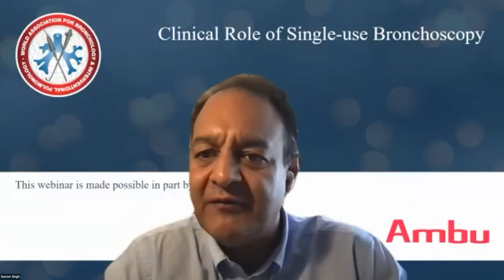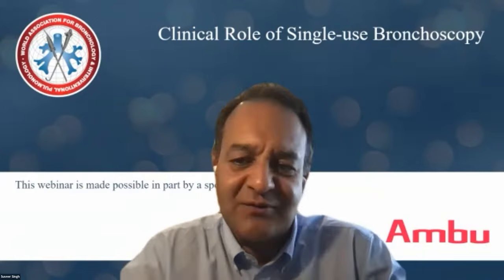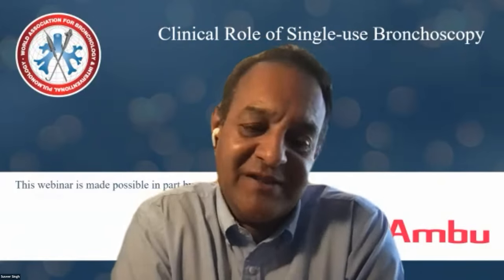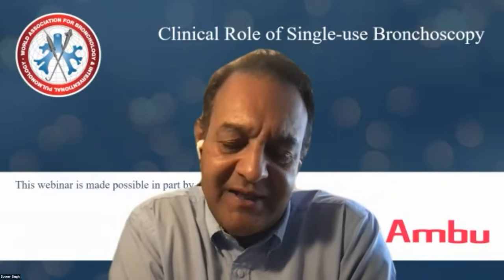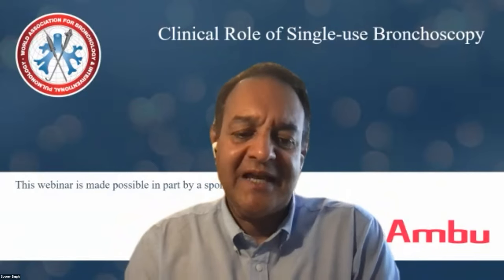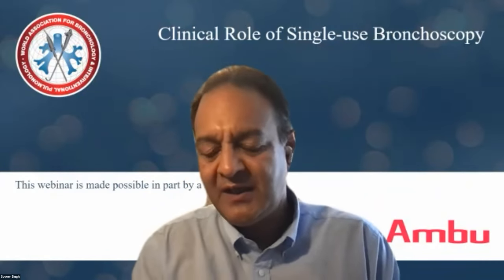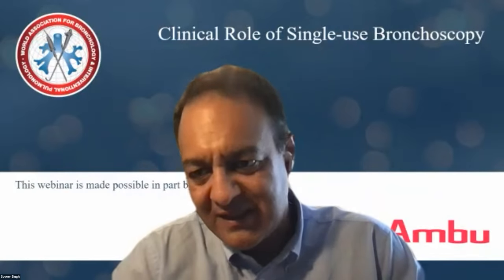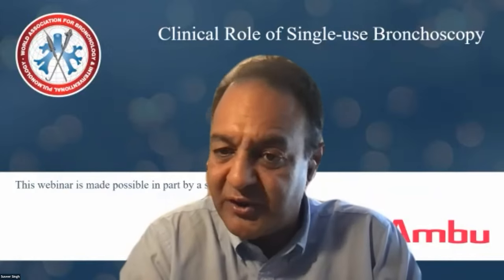We have a question here from Fotios, who asks, is it safe and meaningful to reuse a single use bronchoscope on the same patient after manual cleaning? It's a great question because it's a vexed issue. These are single use for the reasons that we said, and they are developed as such. There is some limited data from Brendan McGrath and others that have bench tested these scopes that have been left out and haven't been cleaned or have been cleaned. And there is a definite significant increased risk of persisting contaminated bacteria within an 8-hour period of sedentary use. Now, the question is, what if you flushed and cleaned these single-use bronchoscopes? The answer is we do not know, and we don't have robust evidence.